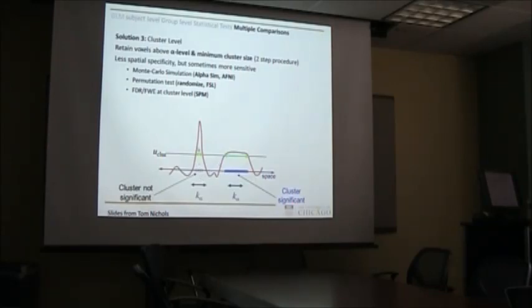But actually, this voxel that we determined significant in the voxel-wise approach is not significant because it might just be one voxel, right? So in reality, it's not always as either-or as this example, but this is how to think of it. Depending on what method you use, you might end up with different brain regions.